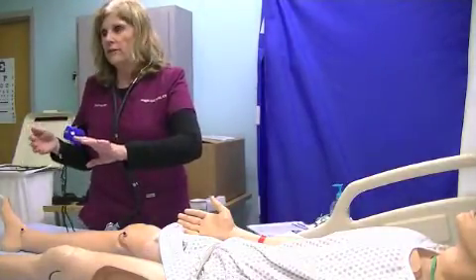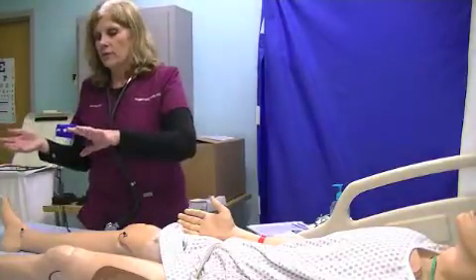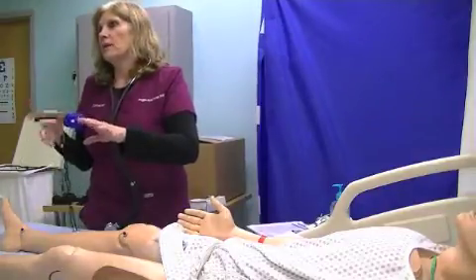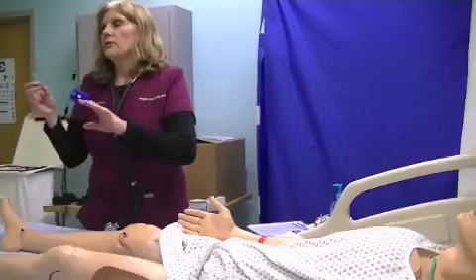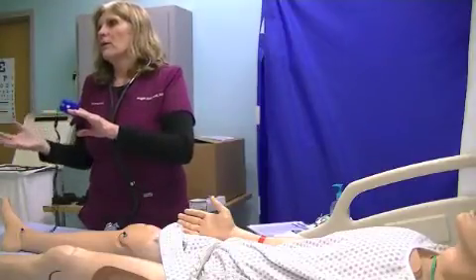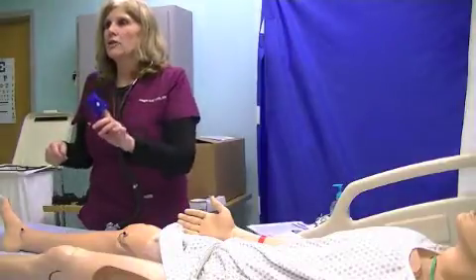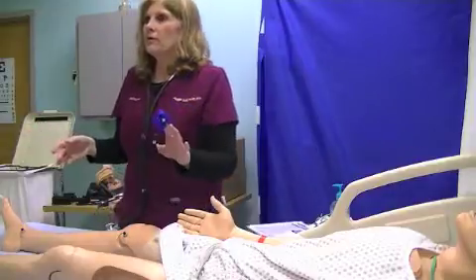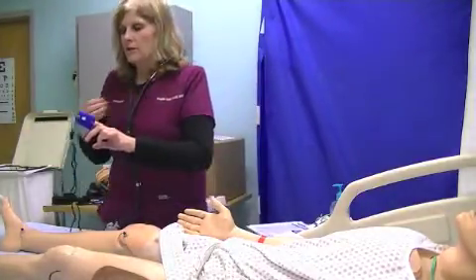Usually 95 to 100. As you get older, over 60, a lot of times some of them, especially with respiratory diseases, run between 90 and 92. The doctor will also write orders for what oxygen saturation to keep their O2 level on. So anybody on oxygen, anybody with a respiratory problem, and any patient, as part of the vital signs, you put this pulse oximeter on and you take their oxygen saturation.